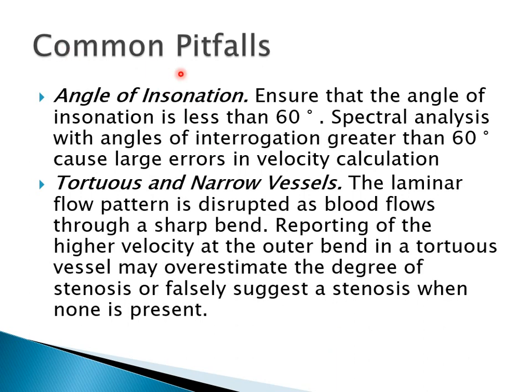In the carotid Doppler study, we have common pitfalls. First of all is the angle of insonation. Usually the angle should be less than 60. Spectral analysis with angles of interrogation greater than 60 will give large errors in the velocity calculation, so we try to keep it less than 60.